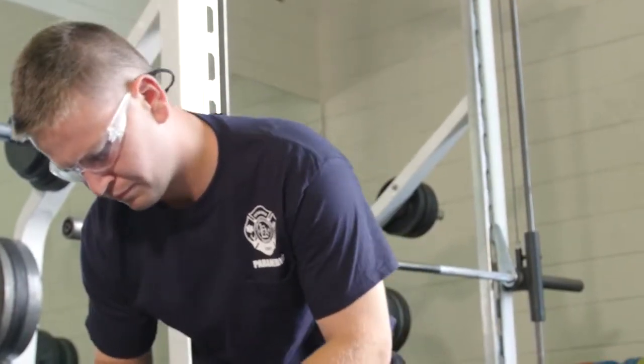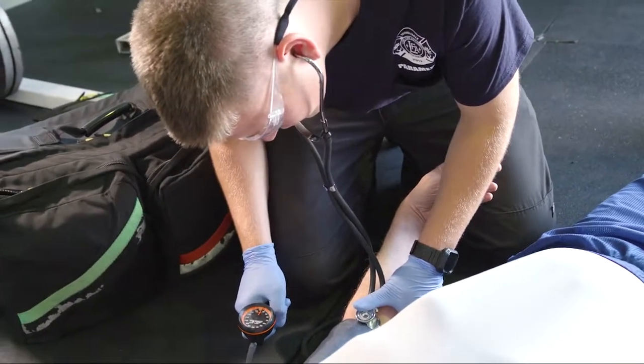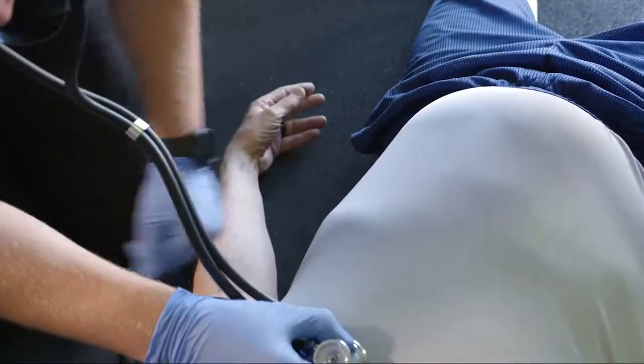Let me go ahead and get set up for a 12 lead. And that's just another point, is that the purpose of getting the 12 lead is not only to confirm your suspicion of AMI, but beyond that, to determine whether or not ST elevation is present, and if so, then to guide them to the appropriate treatment.